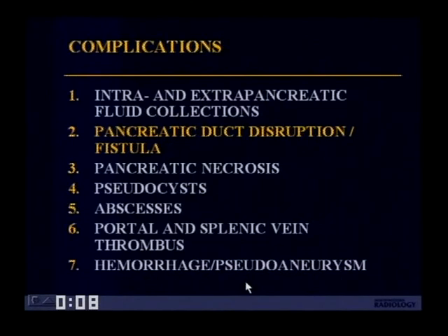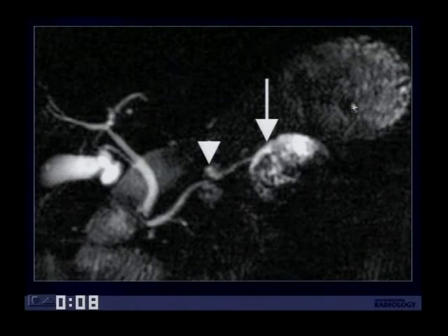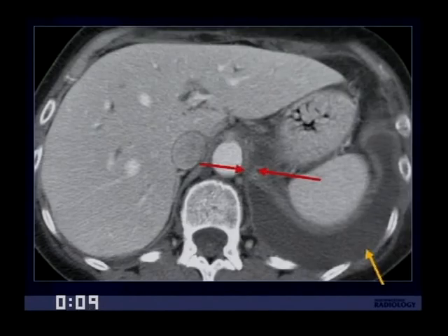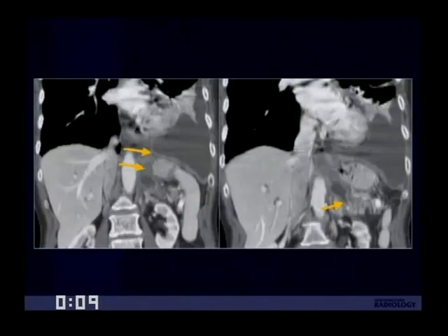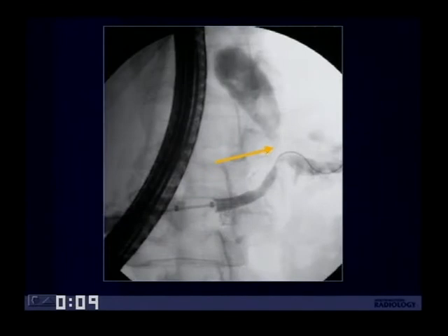Other complications to look for include pancreatic duct disruption or fistulas. Here's a thick slab MRCP showing a normal common bile duct and intrahepatic ducts, a normal pancreatic duct, but notice the disrupted duct and the presence of a large pseudocyst. Patients with pancreatitis can also have pancreatic pleural fistulas due to posterior disruption of the pancreatic duct into the retroperitoneal space, with the fistulous tract extending into the aortic or esophageal hiatus. This can account for recurrent large pleural effusions; about half resolve, but surgery may be required. An ERCP confirmed this diagnosis in one illustrated patient.